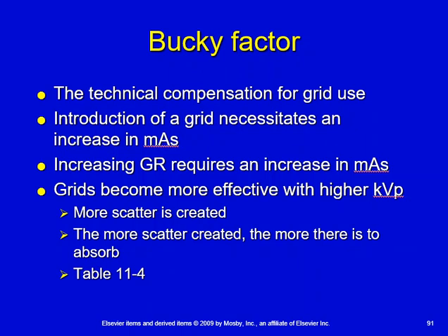But if you're shooting a chest x-ray at 120 at 2 without a grid and you introduced a grid, what you would need is not 2 times 3, you would need 2 times 4. So your new technique would be 120 kVp at 8 mAs rather than 6.